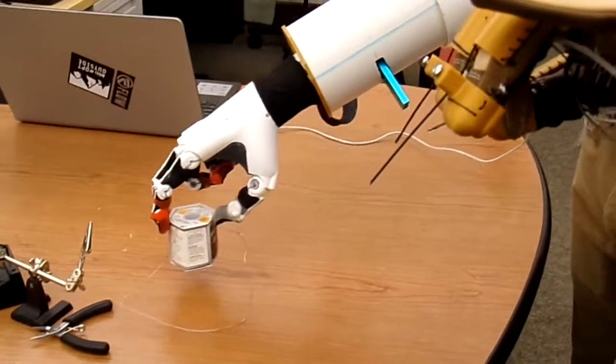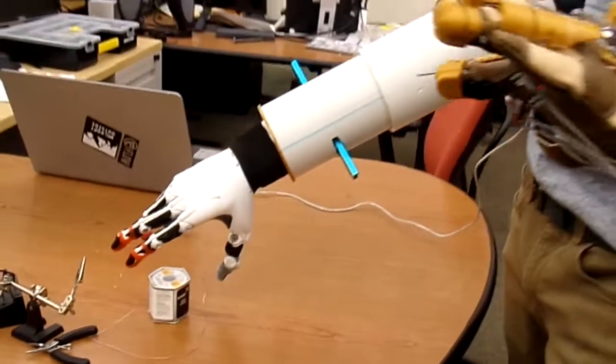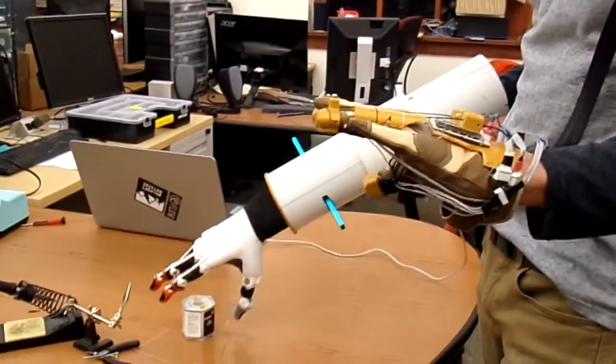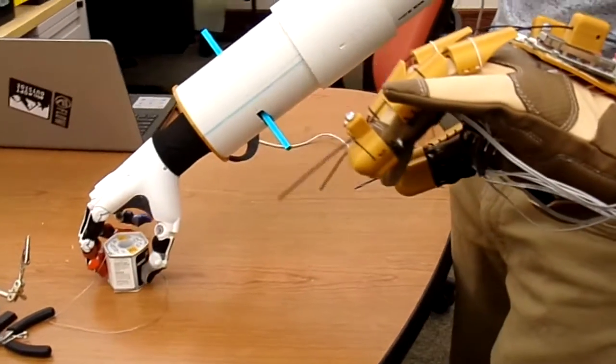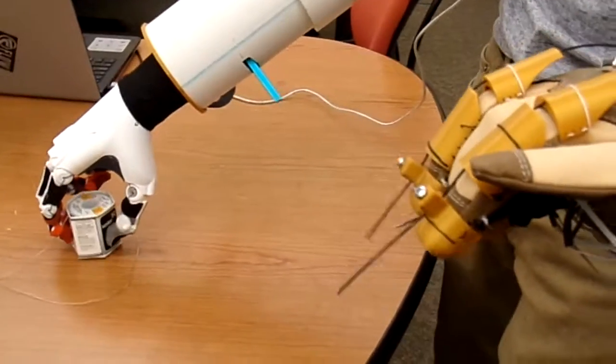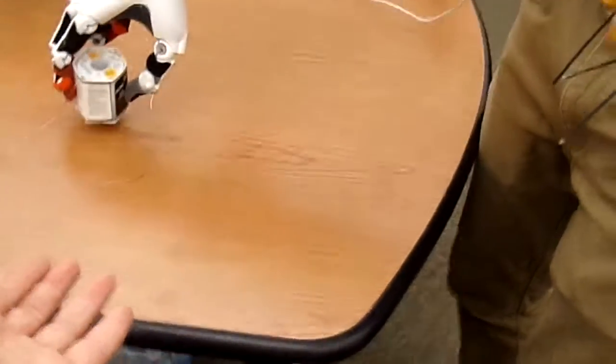Oh, and there's that haptic feedback. Oops. But when I did that, I felt my vibration in my thumb and my index fingers here because of the force sensors on the fingers. This is a pretty heavy object. Hey, there we go.